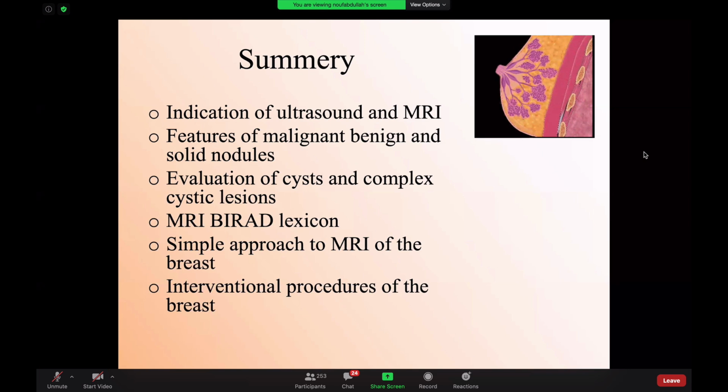Okay. The next from Dr. Abdul Khaliq. Is a thick or thin echogenic capsule on ultrasound considered as a BI-RADS lexicon term? As I said before, no, because it used to be in the previous edition, not the last one, but I still find it one of the most helpful features. It was described by Dr. Sickles. He's the godfather of breast ultrasound, and I find it's one of the most helpful. So whenever you find the thin echogenic capsule, this is really benign. Whenever you have a thick echogenic capsule, it is very suspicious.